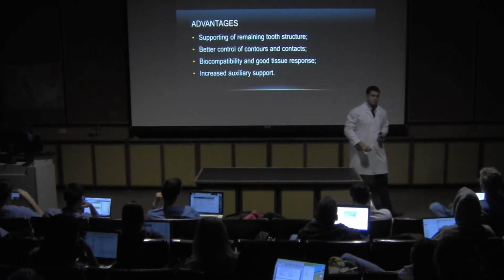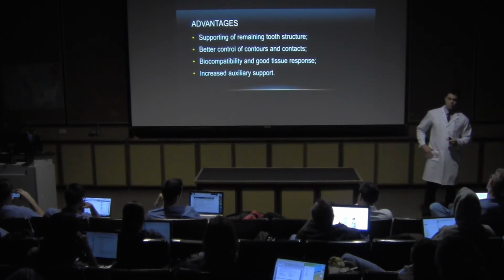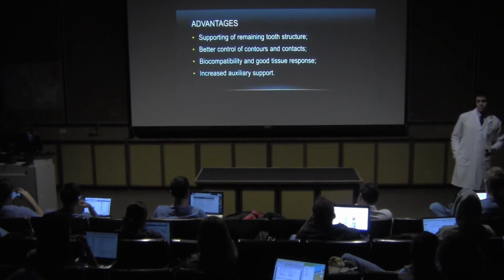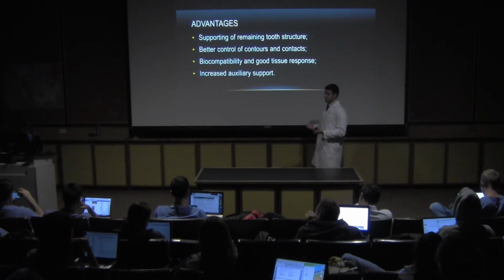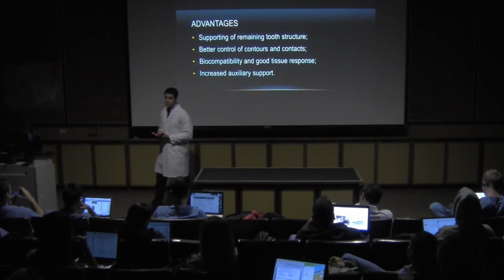Why? Just outside the mouth. Yes. Perfect. It's manufactured outside the mouth. It's much easier to create the restoration.